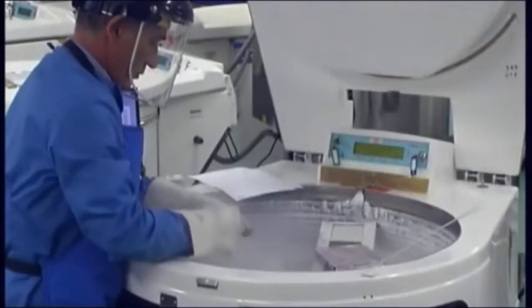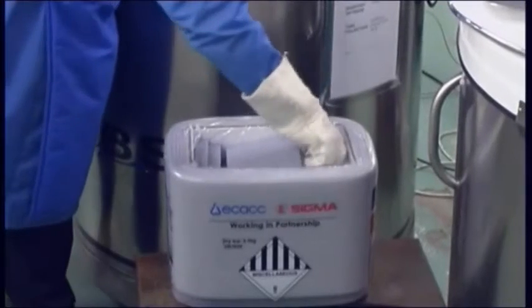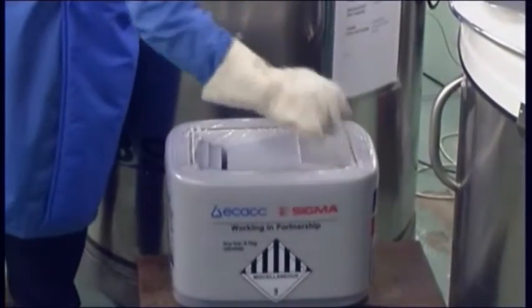Revival of cells from frozen. Cells are often stored and transported in a frozen state and must be thawed to generate a culture. Thaw cells correctly in order to maintain the viability of the culture and enable quick recovery. This is a typical thawing procedure.